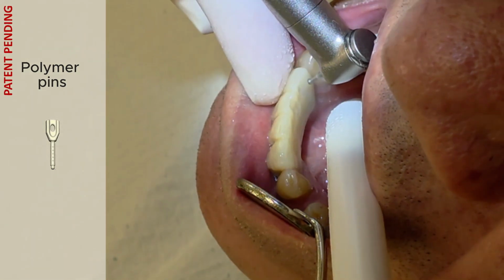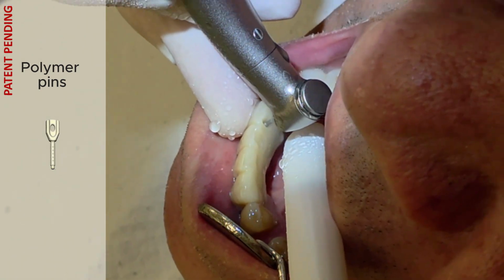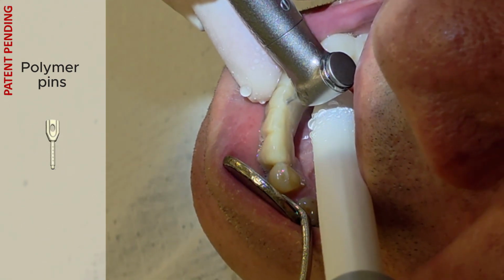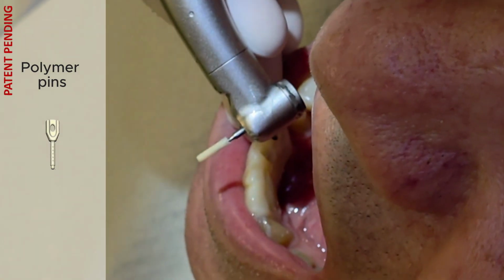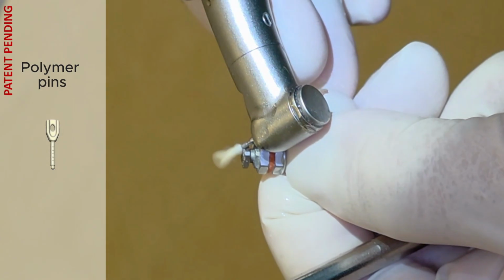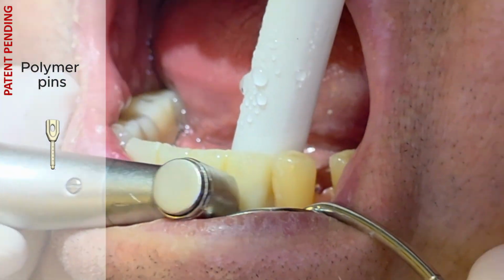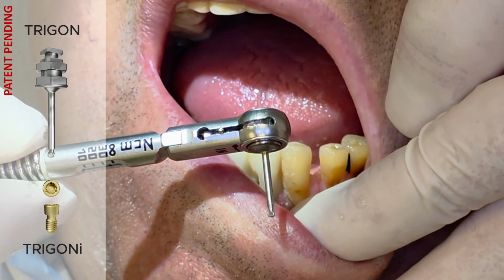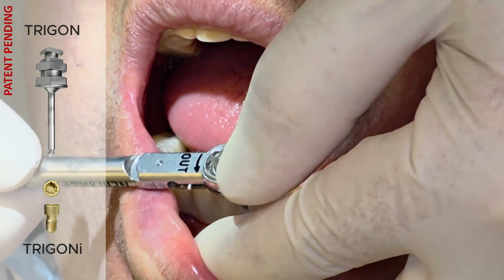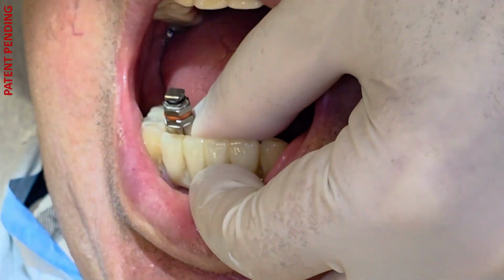Here I show how easily the bridge can be removed when a polymer pin is placed inside the screw channel. First, a small opening is drilled and the pin is extracted with a fine burr, after which the channels are fully open. Using the back of the screwdriver, the pin is detached from the burr. Trigony screws are removed with the trigon screwdriver. The entire bridge removal process takes just a couple of minutes.